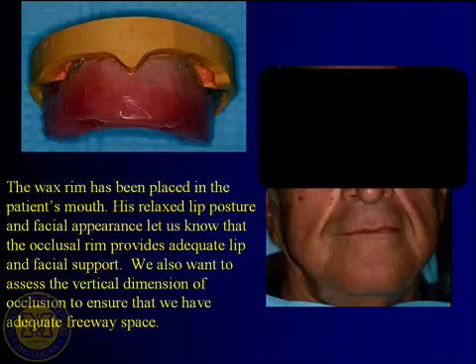Because they can get all over that 2218, but now ask them to just do a right brain thing where you're just looking at the patient's face as a whole and say, does that look generally okay? Well, how many millimeters is it? I don't care. Look at the patient's face. Yeah, but give me some numbers. It's like, get over it, okay?